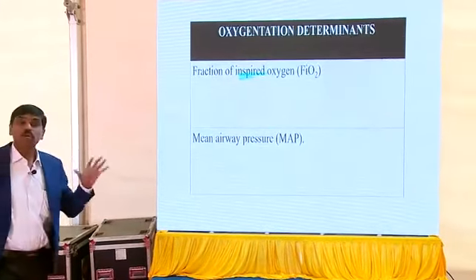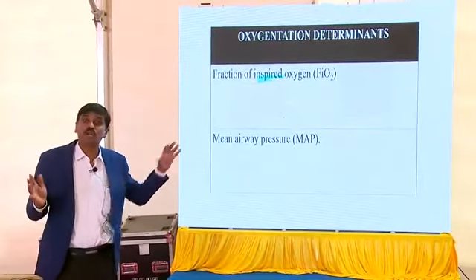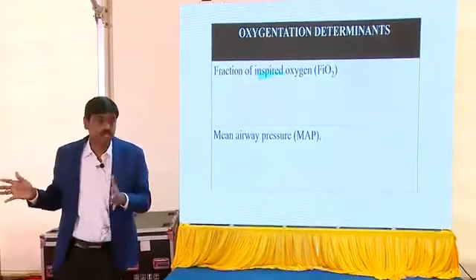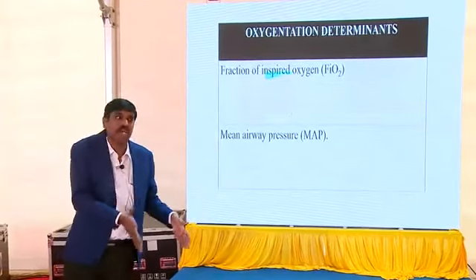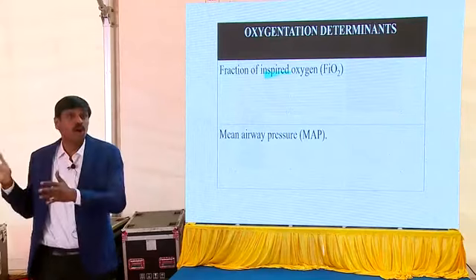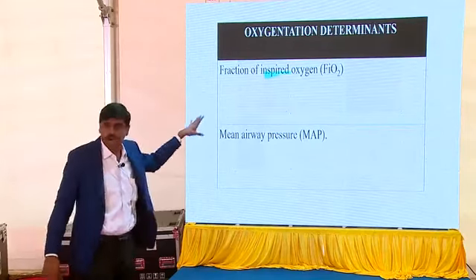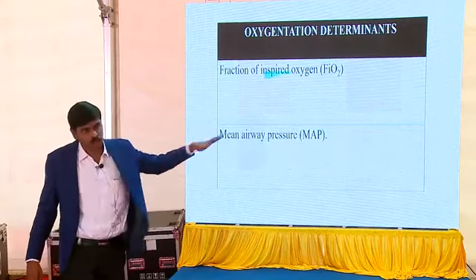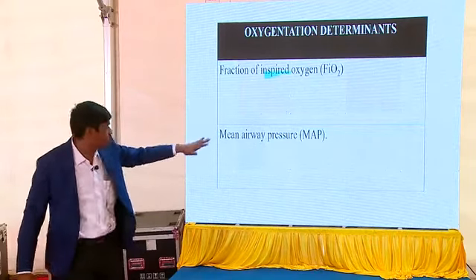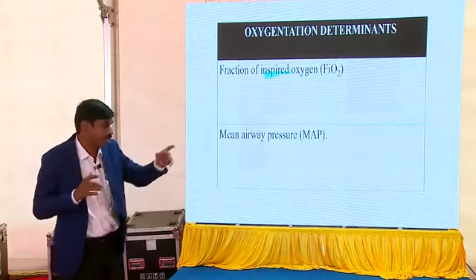So now coming on to oxygenation. Now the entire knobology depends on oxygenation and ventilation. So which knob are you going to twist when handling hypoxia? Which knob are you going to twist when handling hypercarbia or hypocarbia? So first is about oxygenation. The first, as we all know, one of the no-brainers is going to be the FiO2. I'm not talking about that. Next comes the mean airway pressure. Okay, next slide.